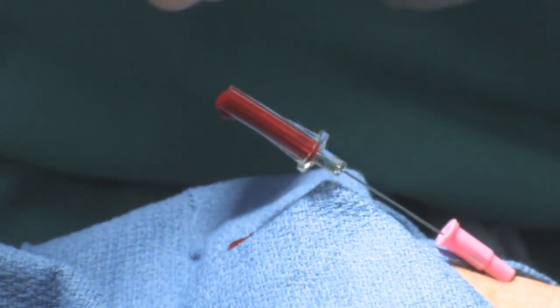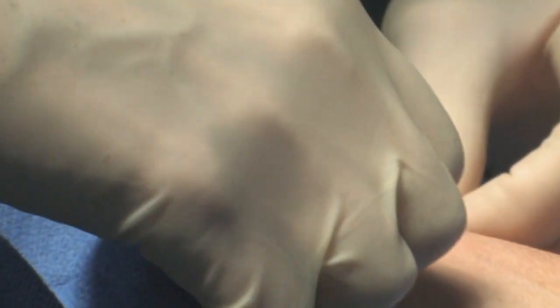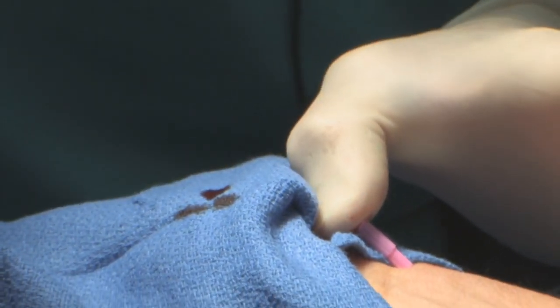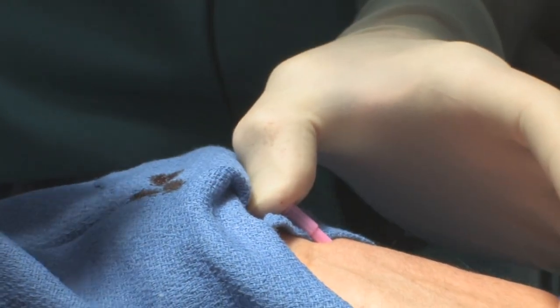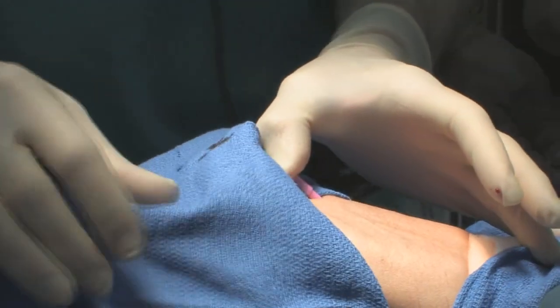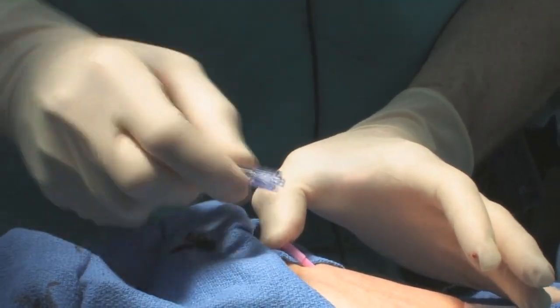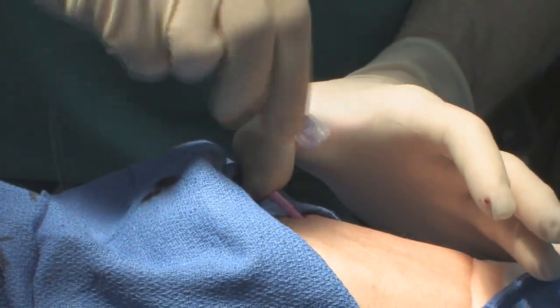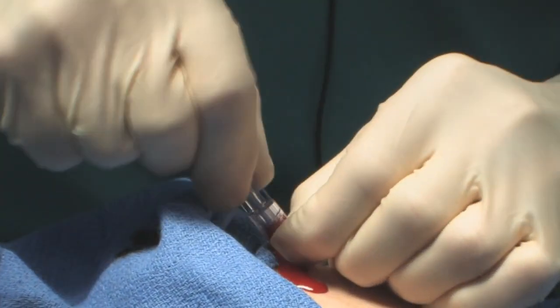If you look at the end of the needle, blood is still coming out — it's in. Now be neat: put the blue cloth under there, your hands are sterile, occlude the end with your thumb. There's blood on my hand — wipe it on the sterile towel so you don't contaminate everything. Take the tubing — I usually have it queued up. When you connect, it will bleed briefly — that's why I have the blue drape under it. Do not turn the catheter; just turn the tubing. Let it go, it bleeds, then you twist it on.